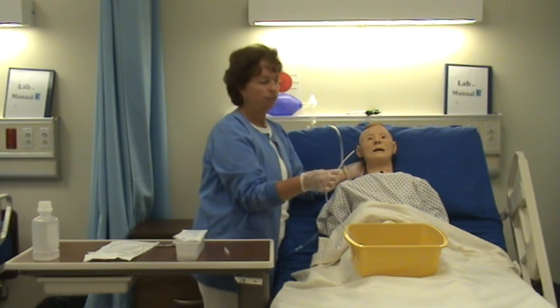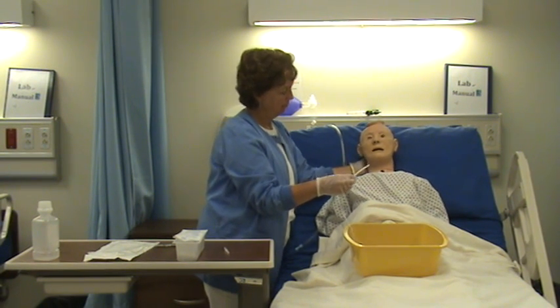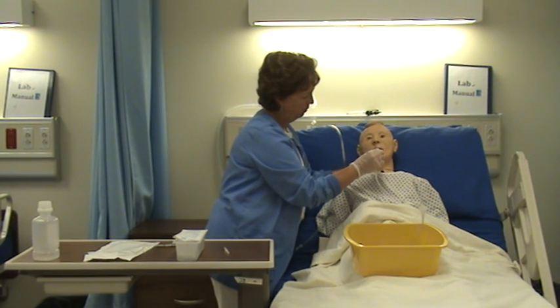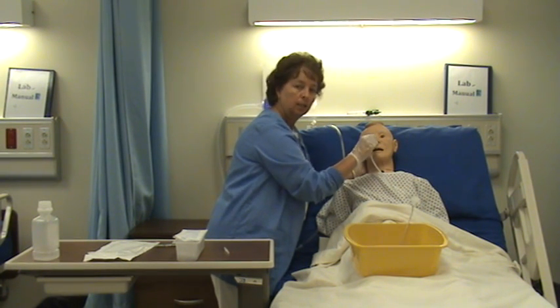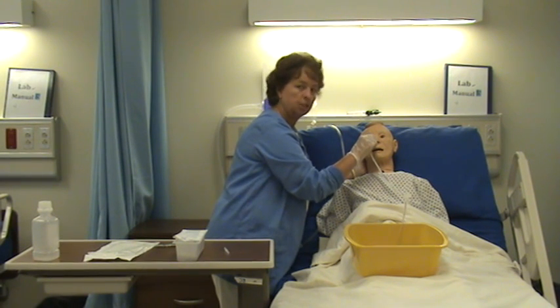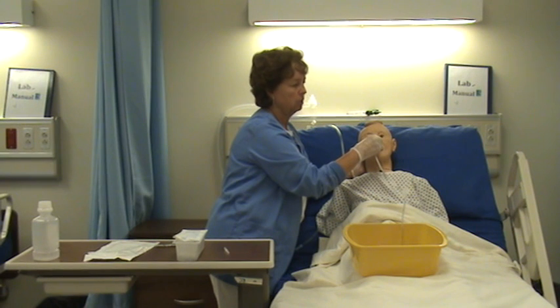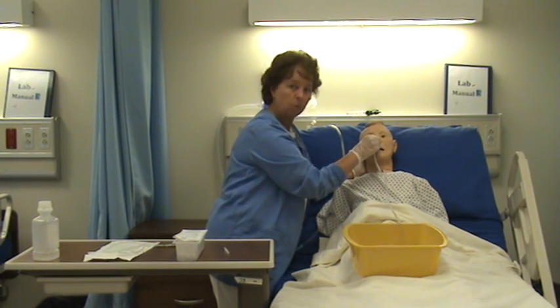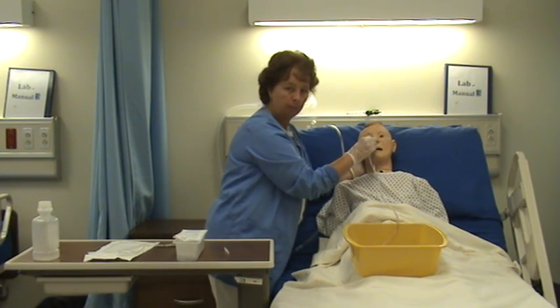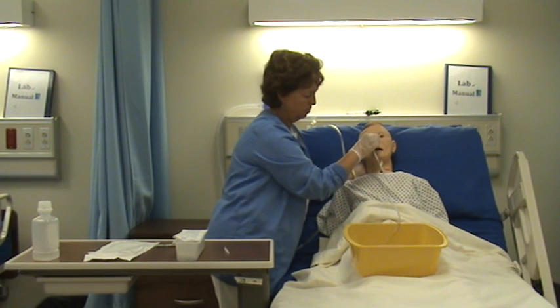If the patient can take fluids, it's really helpful to have someone give him a sip of water as you insert the tube. With my hand behind his head, I put the tube in the right nostril. When you get to the back of the nasal area it curves and you'll feel a little pressure. Go a little further and you'll hit the gag reflex. When the patient gags, pull it back slightly, tell him to take deep breaths and swallow. Insert the tube as he swallows, then give him a break. Usually it takes about two swallows to get the tube in.